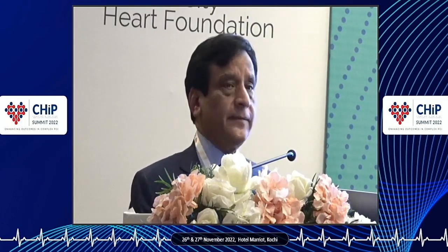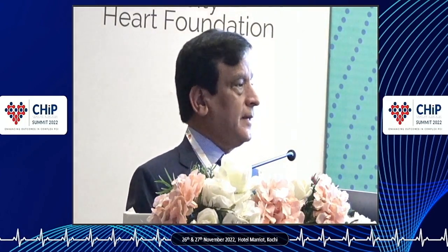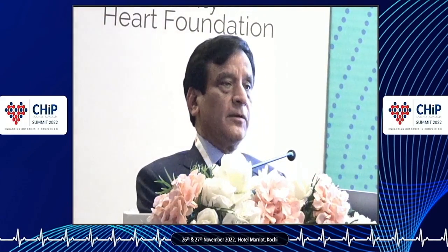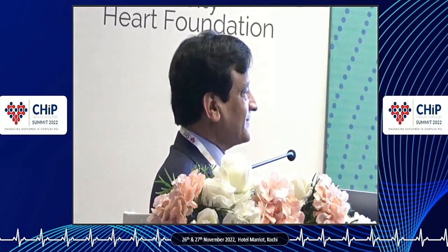So the goal is lesion expansion, whichever technique you use. The algorithm we have shown is just to facilitate the ultimate goal, and that is that your stent has been fully expanded.